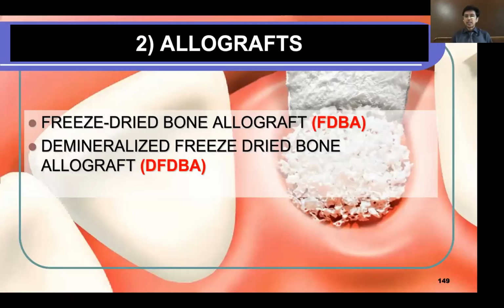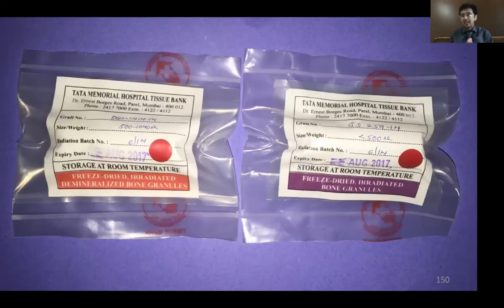Now, the second bone graft, coming to your question: which is better, FDBA or DFDBA? These are the two bone grafts I have been using for the last 18 years, right from my first year of PG, 2002. I'm lucky to have very good students practicing in Bombay, from whom I have been able to procure them, because this bone graft is not supplied commercially. You need to get it in person from Tata Memorial Hospital only.